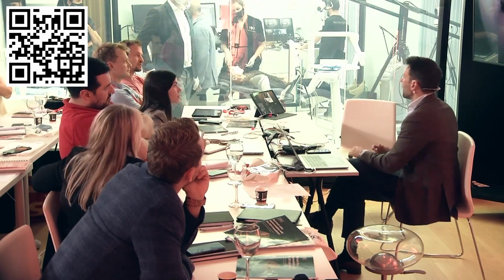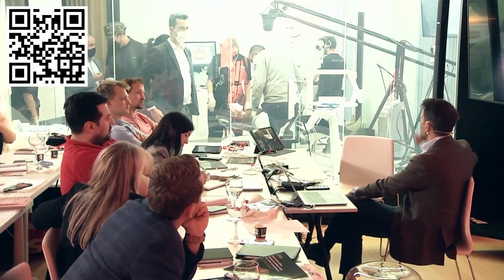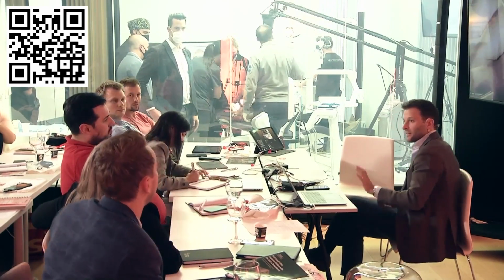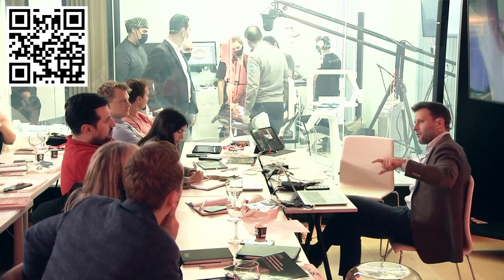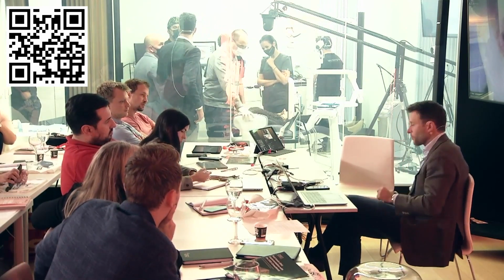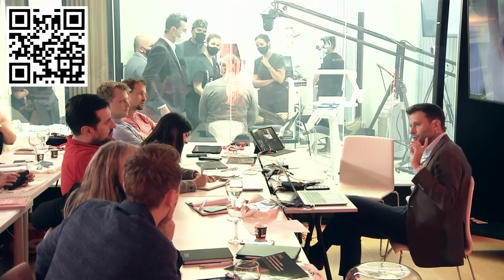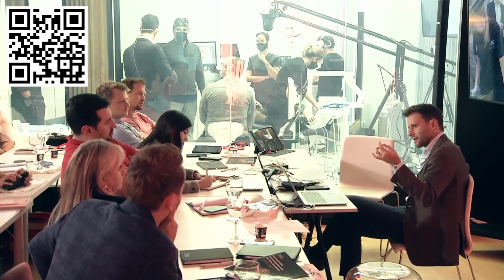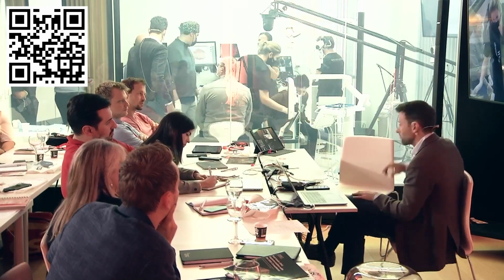Chris, we're going to take some photos now, some facial photos. Why? I didn't see. He was unscrewing and screwing again. No, he just screwed in this bridge, right? Just screwing. She was with an old bridge that is useless. Now we want to deliver a new bridge for her. Before we mill the final zirconia, we want to send you this prototype in cheap printed material for you to check and give us the green light in these 3 things: passivity, aesthetics, and function. So he was just screwing in.